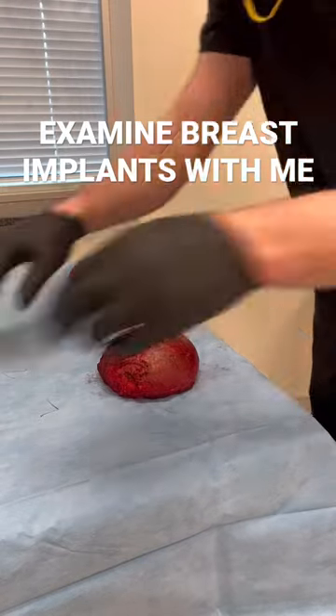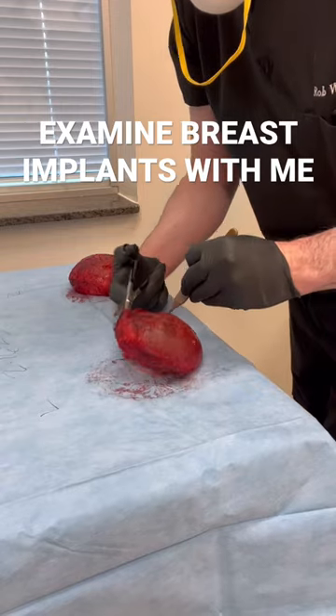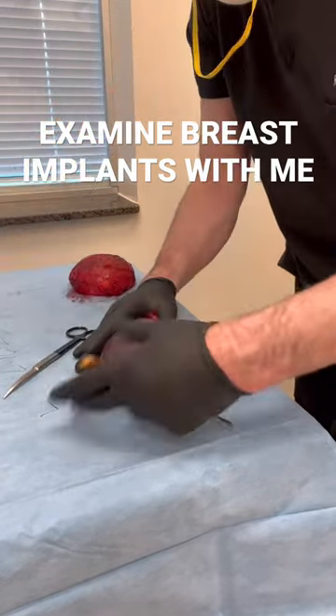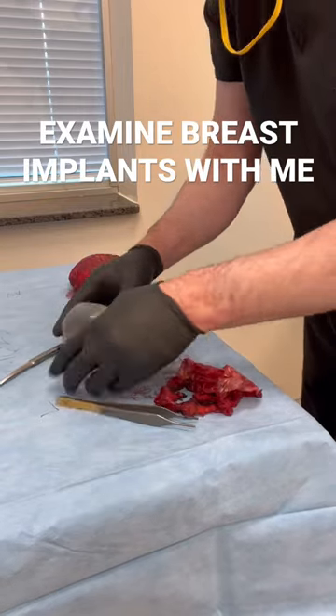Hey, it's Dr. Whitfield. We just finished a en bloc capsulectomy. We're going to examine these devices — super thin capsules that are easily torn when you take the implant out. You can see the fill valve there.